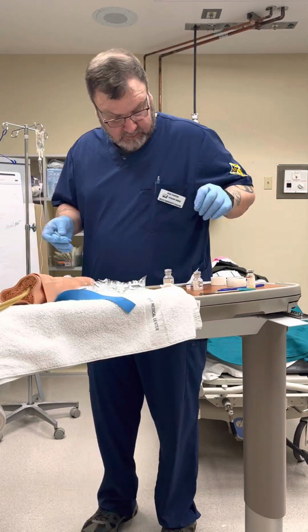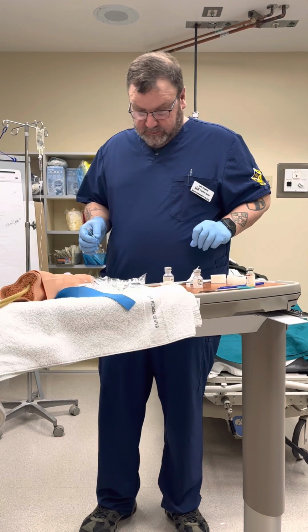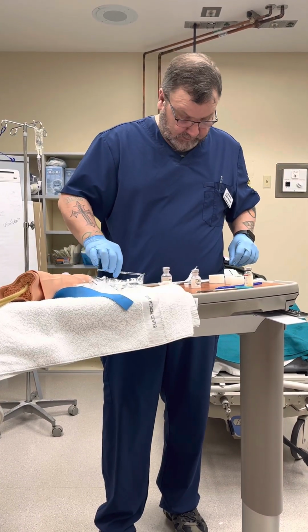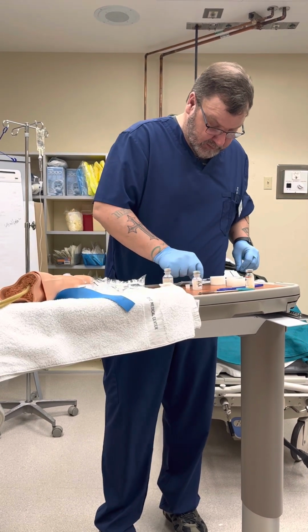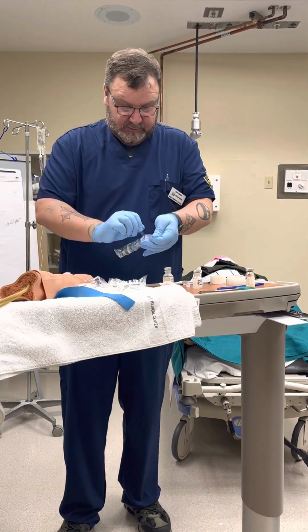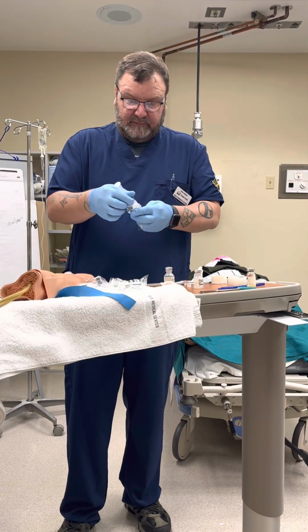So now I need to flush this. So I would do the swoop and scoop method for my needle. I will take out my flush.